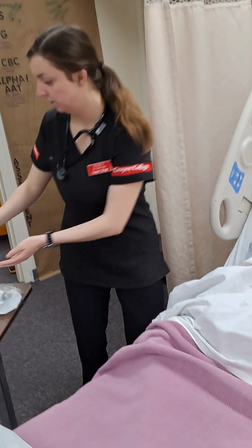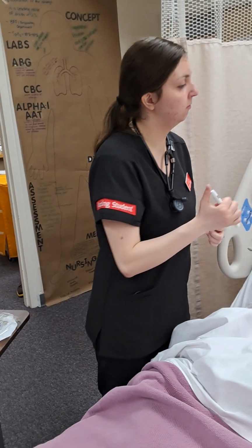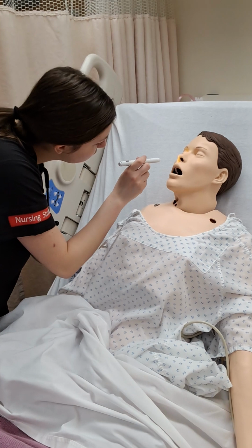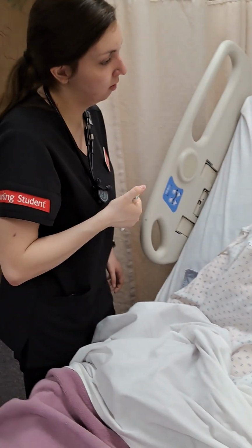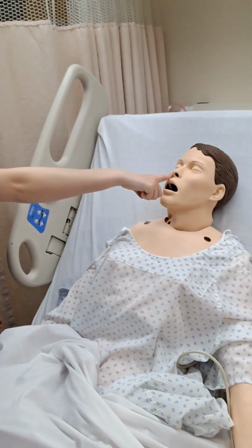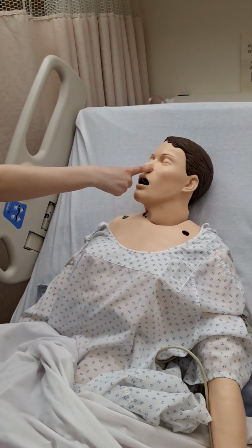Okay. So now I'm going to inspect his nares. I'm going to look at the skin integrity and his airflow. His skin integrity in both nares is clean, dry, and intact. I do see a little obstruction of mucus in his left nare. So now I'm going to assess the airflow. Breathe in. Breathe in. Okay, his right nare has more patent airflow, so I'm going to insert the NG tube in the right nare.